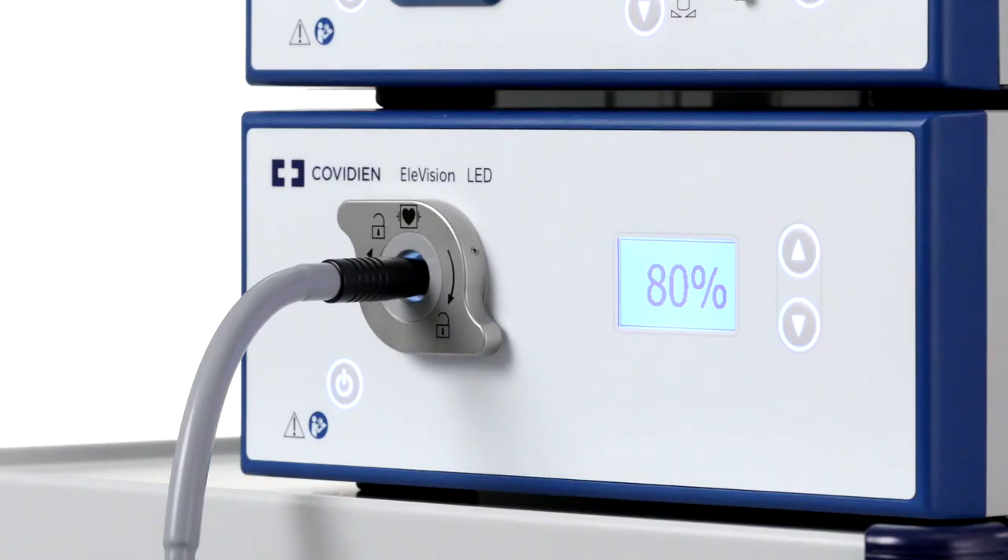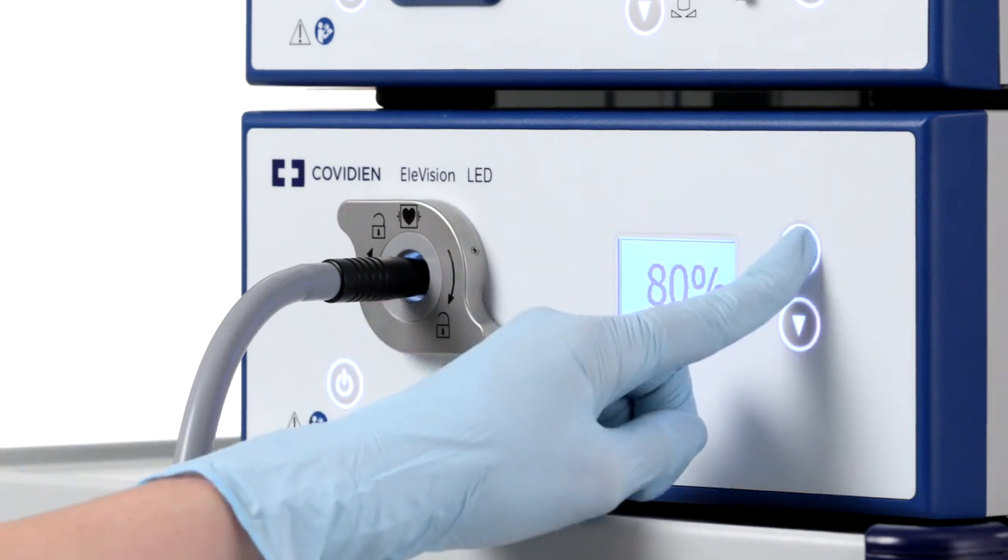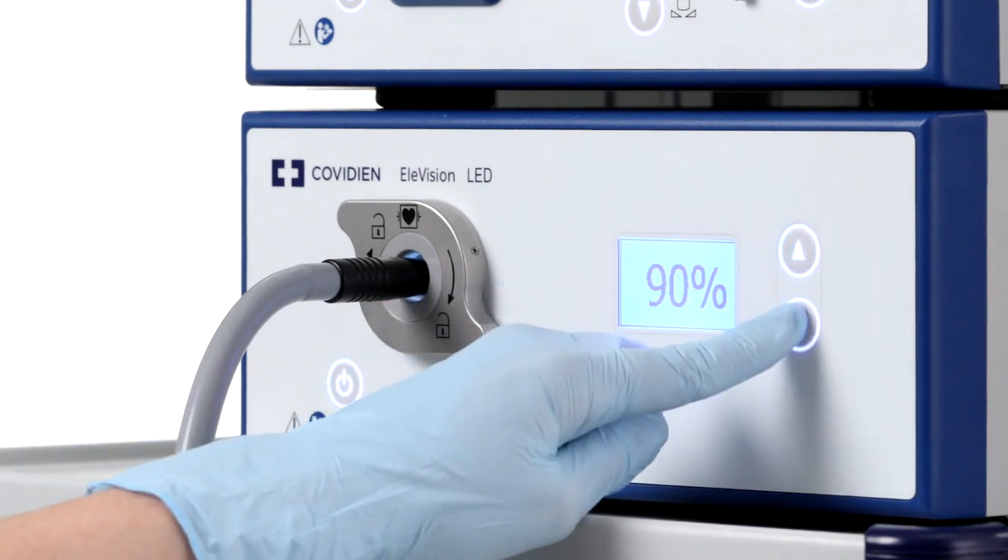The system operates in auto mode. If you want to switch to manual mode, press the up and down buttons to adjust the light intensity.